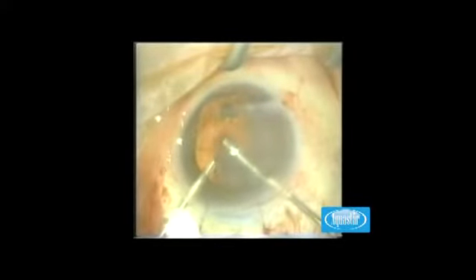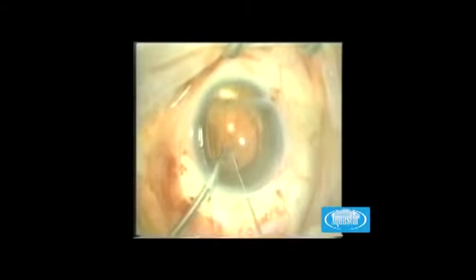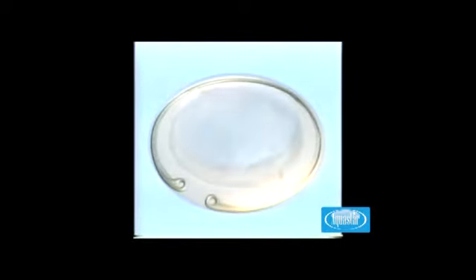The nucleus is released in a simple way. The cortex of the lens can be easily removed from the capsular bag, stabilized by the capsular tension ring. The specific endocapsular implantation of the intraocular lens occurs with the capsular tension ring in place. An IPS single element, which has a C haptic, is positioned in the area of the coloboma of the iris. In this case, the single element completely fills out the zonulolytic area. Normally, it's positioned without tension in the equator of the capsular bag.